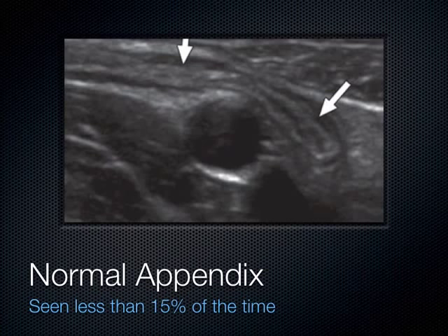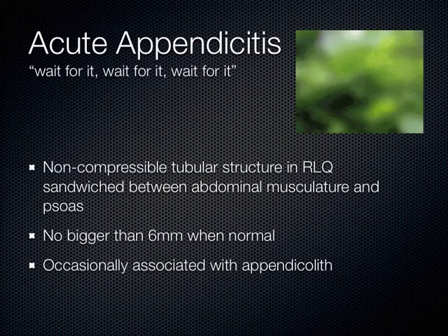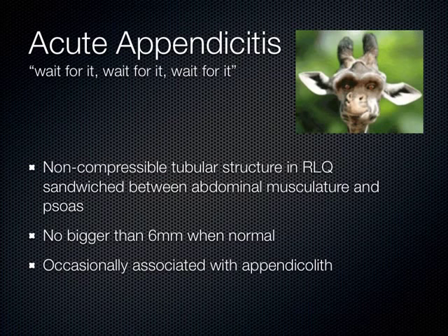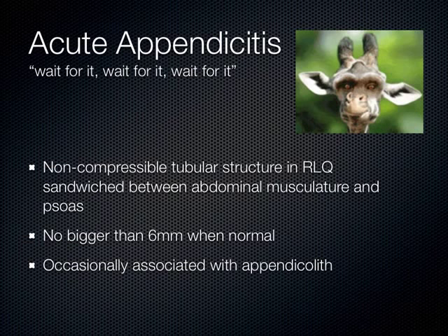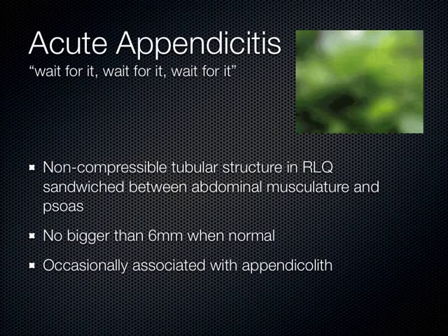When you look for the appendix, you search for that non-compressible tubular structure in the right lower quadrant sandwiched between the abdominal musculature and the psoas muscle. You mow the lawn down in that right lower quadrant — transverse, sagittal — and all of a sudden it pops its head out at you, then it's gone again. You hit freeze and scroll back, or keep compressing. There's a lot of art here — it's very operator-dependent, but over time you do get better.